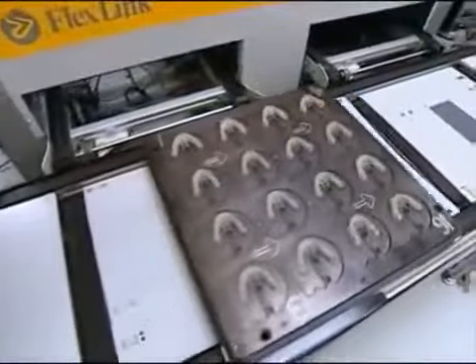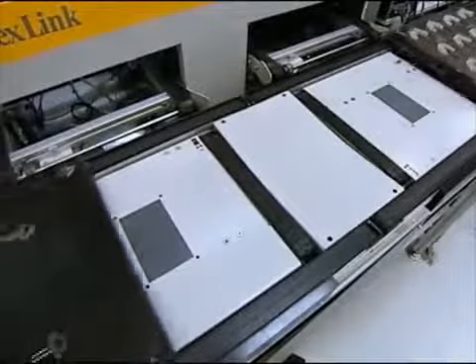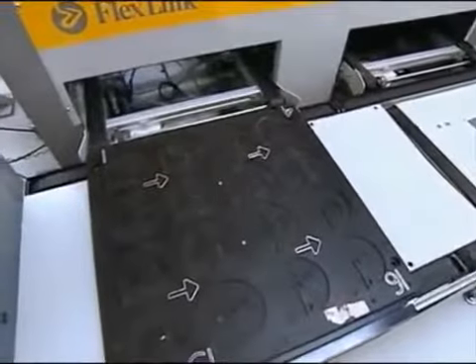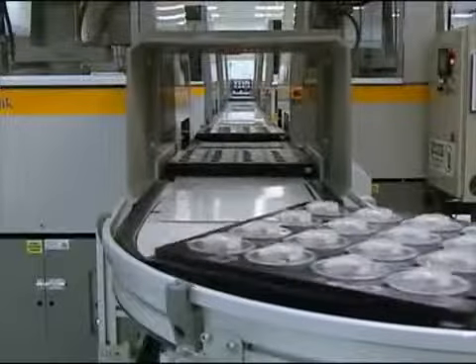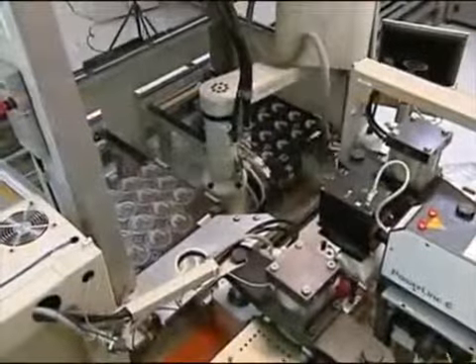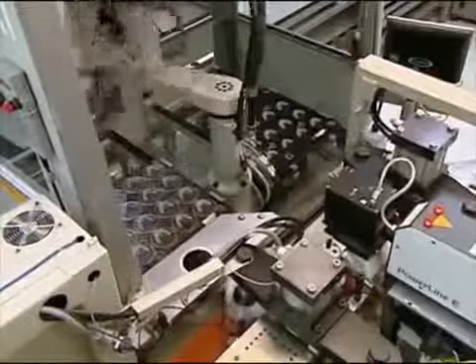The models will now go automatically down the conveyor system to various manufacturing processes. Another tray comes in, reloads, and the process continues. As it moves on the conveyor, it goes through a number of different steps, such as the forming and marking operations, where we actually thermoform the polymer over the aligner mold.